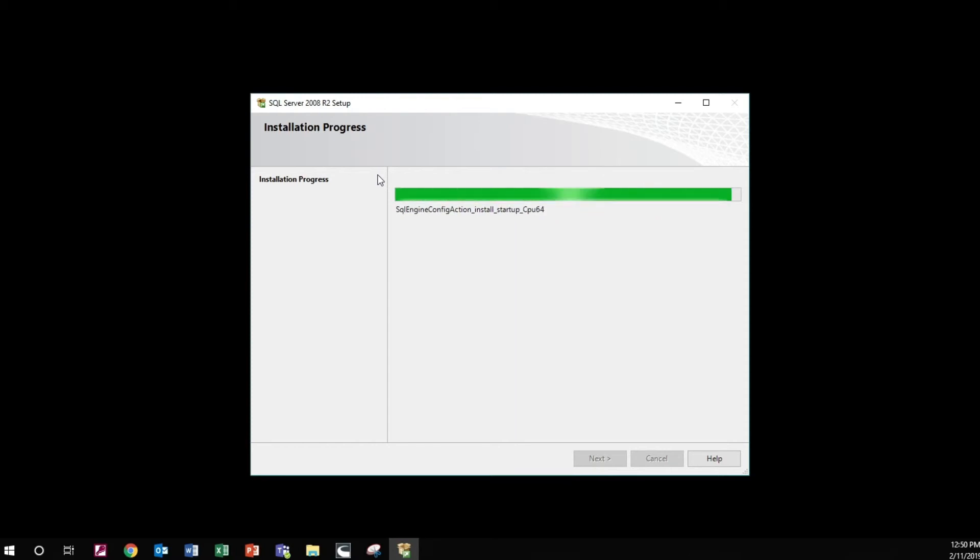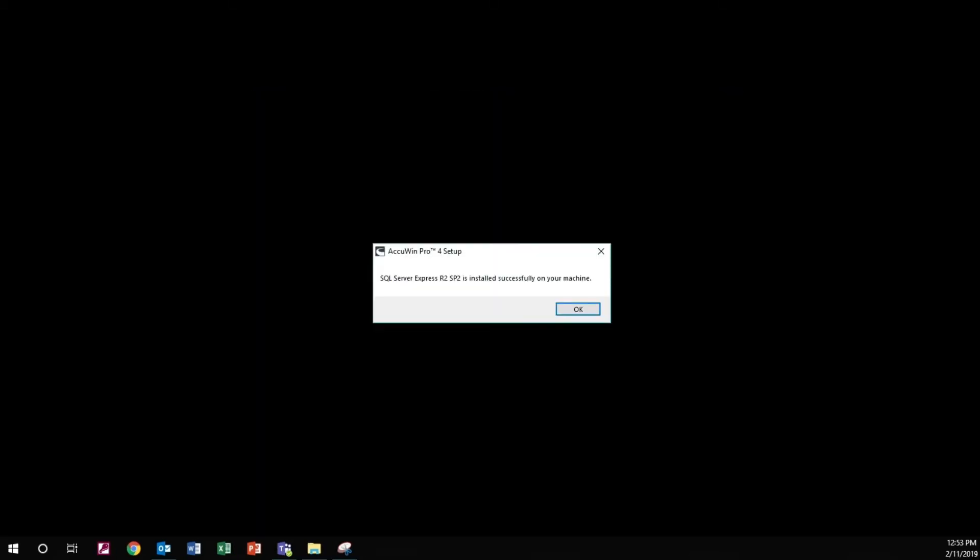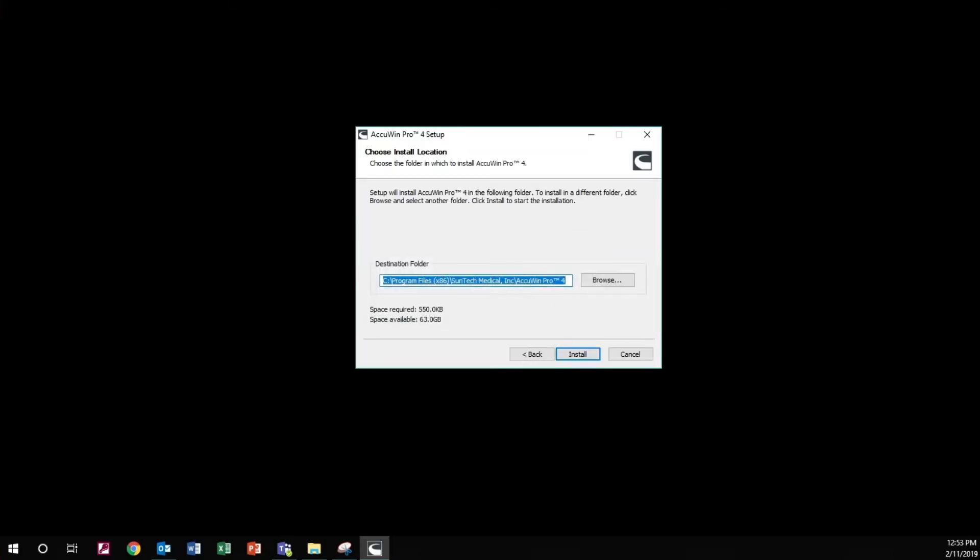This process may take several minutes to complete. Once the SQL server is installed, you will see this window. Select OK to continue the install.